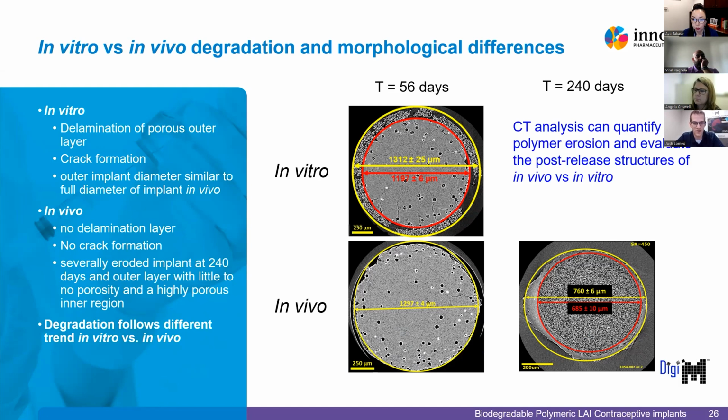In this case, we're down to around 700 micron. And here we can even visualize, at the leftmost portion of the yellow circle, a little bit of lingering tissue on the implant as well.